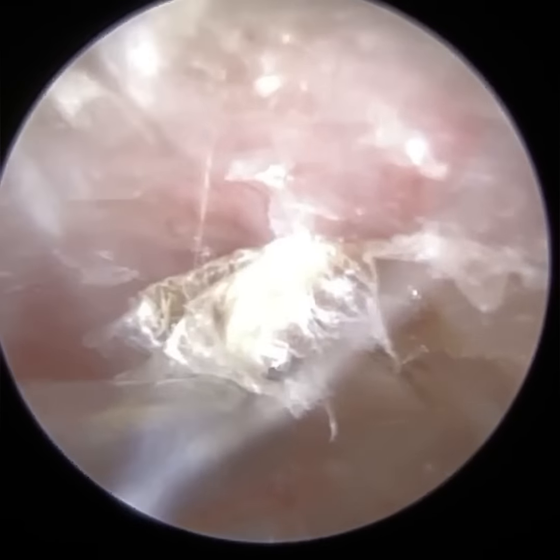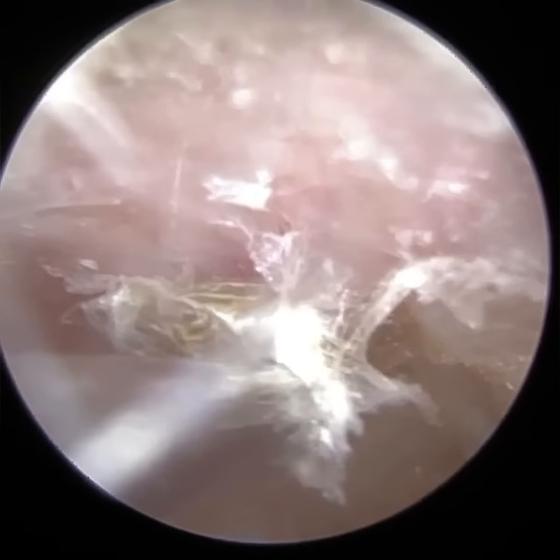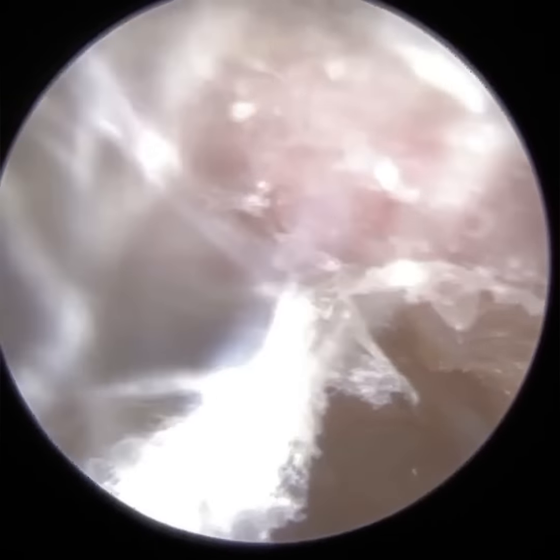So the reason why I was explaining that is because this crusted skin is on the eardrum. As you remove it, it did probably rupture some of those blood vessels. There was no active bleeding, but you can see it was a bit inflamed there afterwards. But it put up quite a good fight. I couldn't use any oil because of the perforation. If the patient was satisfied, I would have preferred to kind of leave this skin, but they could still feel it being really uncomfortable. And you can imagine why.